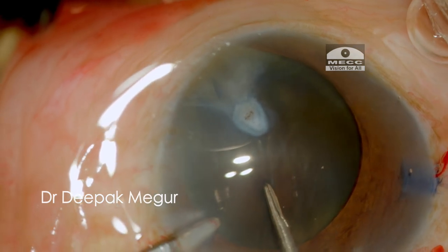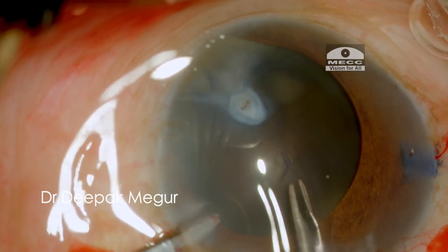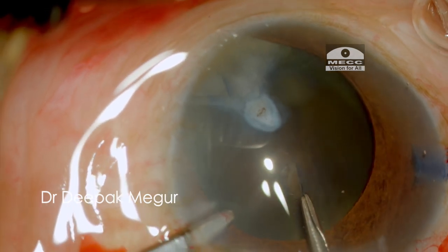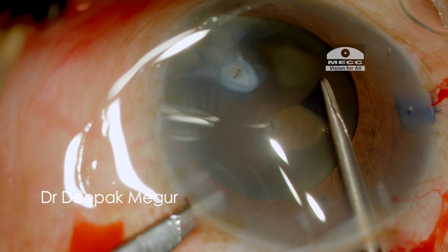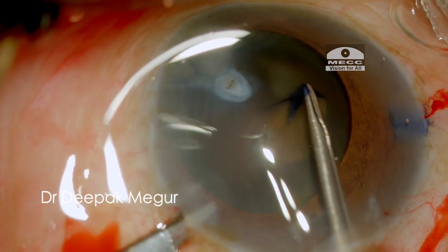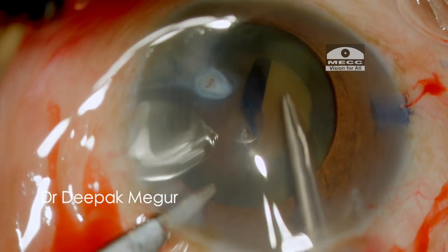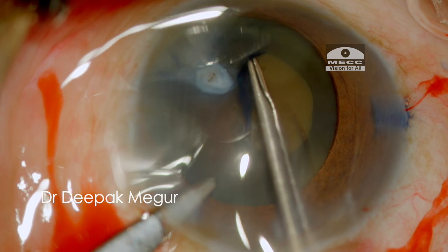As I try to puncture the anterior capsule, wrinkling of the anterior capsule is an indication of the loose zonules in this patient. The rhexis is being performed carefully with the forceps, which is providing me better control, and the tearing edge is gently maneuvered.